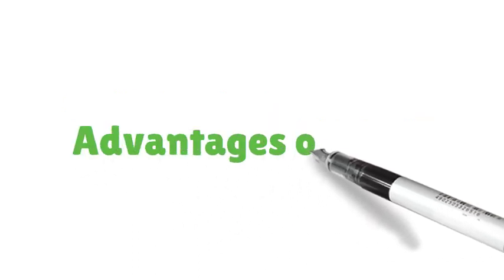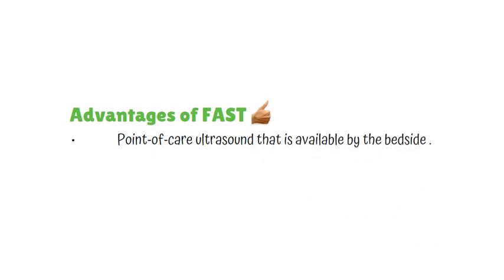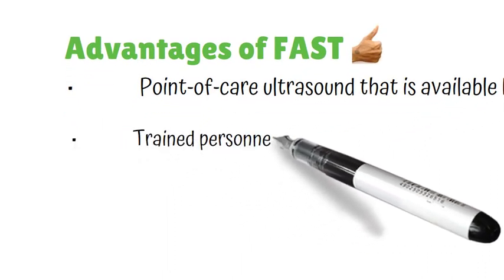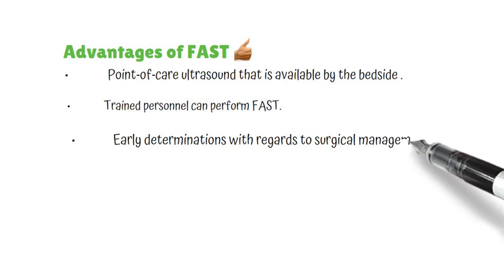Let us look at some of the advantages of FAST. As we've already established, FAST is a point-of-care ultrasound tool that is available by the bedside. Therefore, the patient does not need to be moved or transported from the emergency department. Any personnel that is trained in FAST can perform FAST. FAST also allows early determinations with regard to definitive surgical management.